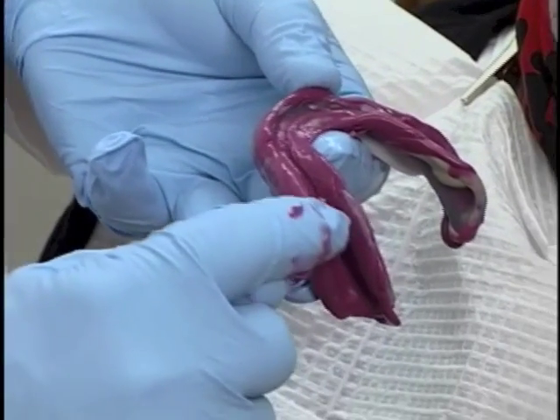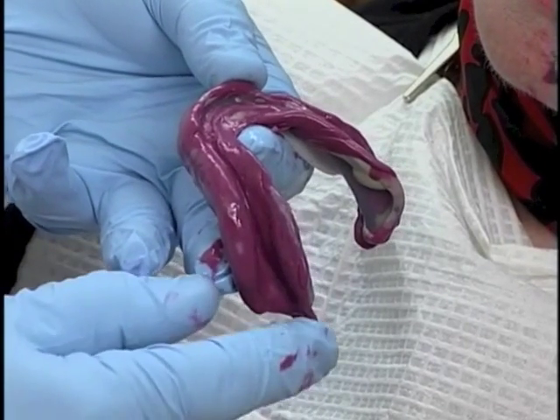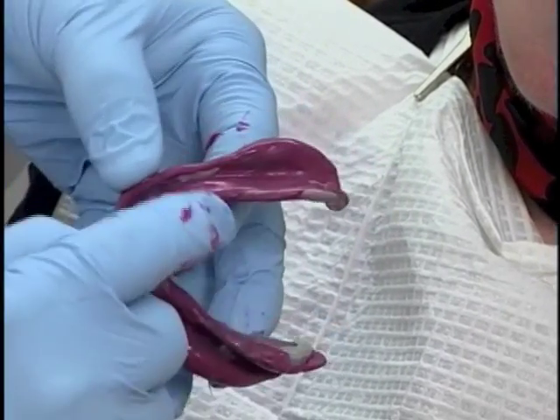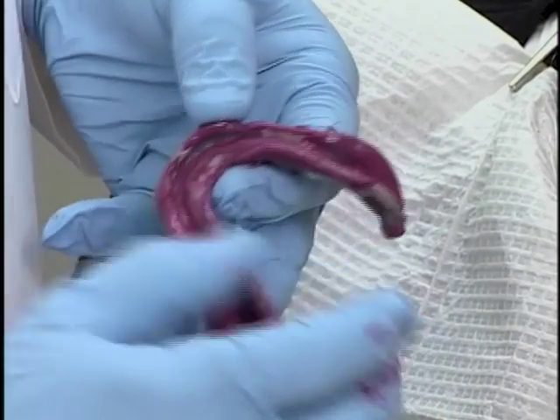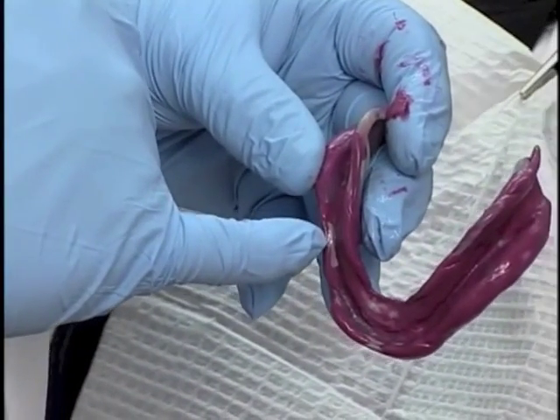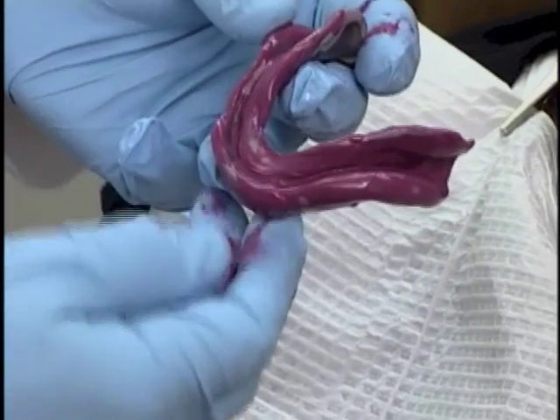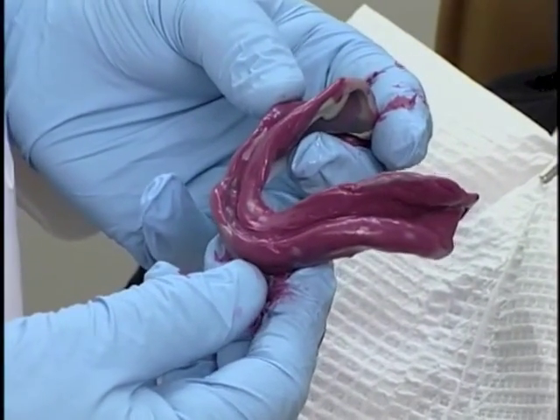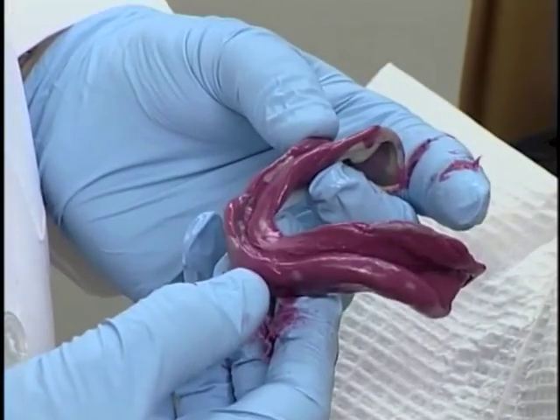We see that we have a little tray showing through on the distal lingual on the patient's right side. We also have a little tray showing through on the patient's left side. We have a little bit too much pressure in the area of the premolars here and across this labial. So I will want to redo this impression because those pressure areas would be detrimental to the final fit of the complete dentures.